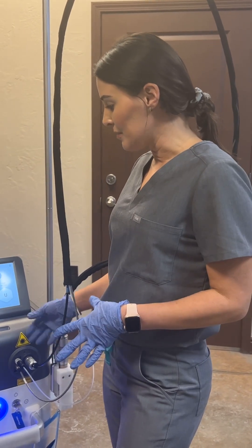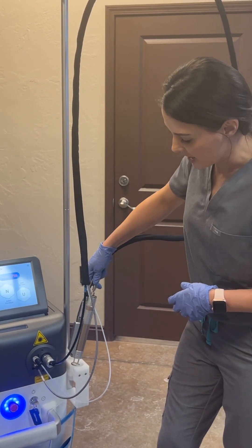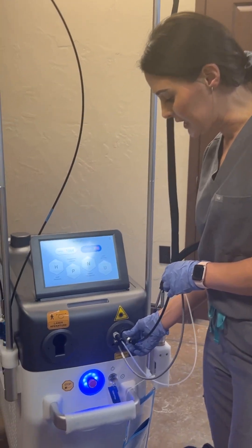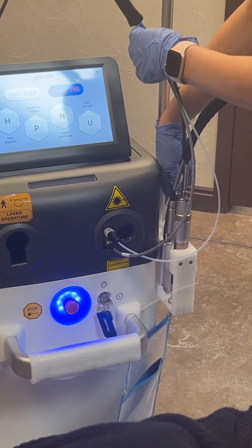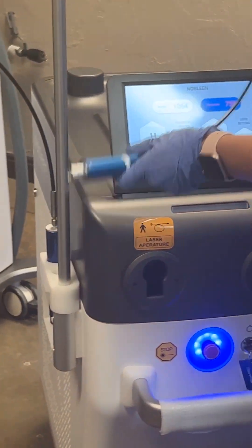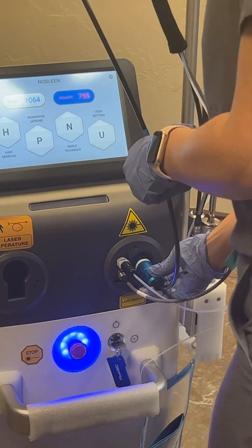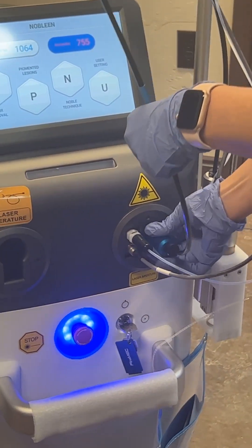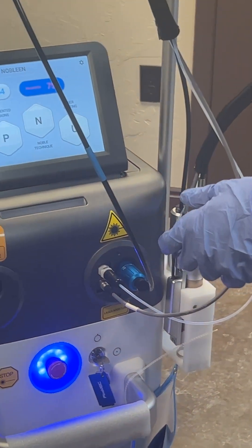To change from using this handpiece and switching to the fractional — what you do is you push in, twist, put it to the side, grab the end of the fractional, push in, twist, and it's secure. Now you have the fractional, it's ready to go.